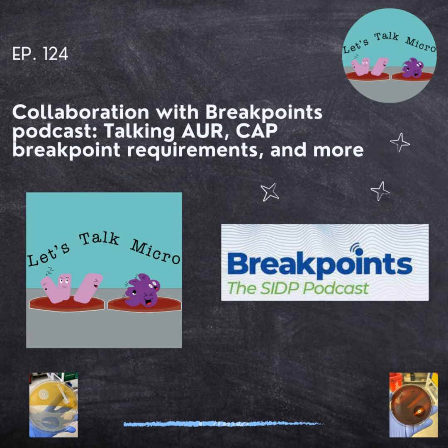And I think the biggest one there is definitely the January 1st one of making sure your breakpoints are updated and validated. So a little bit more. What does updated breakpoints mean? What entity is it being updated with? Or can you just have your own?